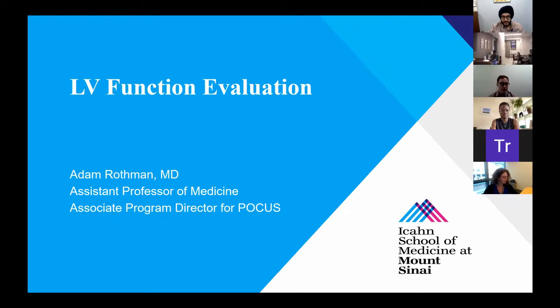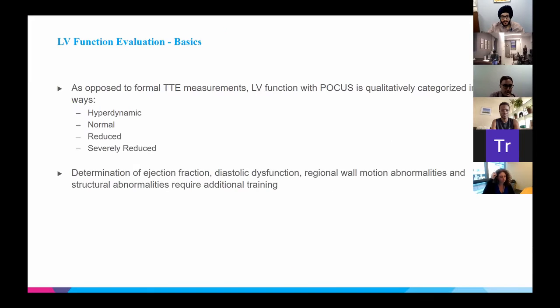And then, for the second half of the lecture, we're going to be running through a series of clips where I would love your feedback. Obviously this is via Zoom, and it's hard to learn ultrasound via Zoom. So what we're going to try and get you to do is answer your thoughts through a series of polls, and then we'll work through and discuss your answers as we move forward. So getting right to it.